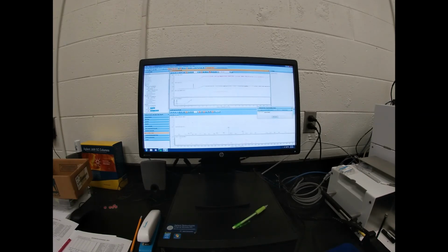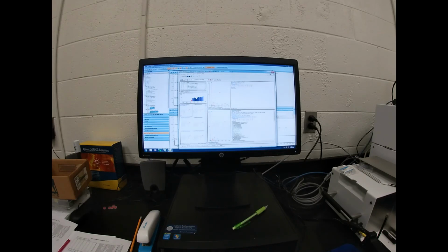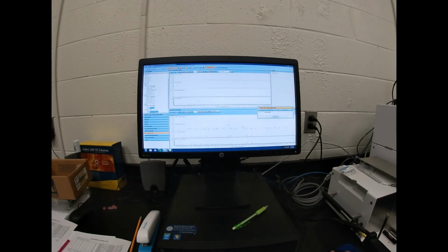Let's stretch this out a bit. Sure we're in the center of our peak. There we go, we get some methamphetamine, as we expected. So this one is not what we anticipated.